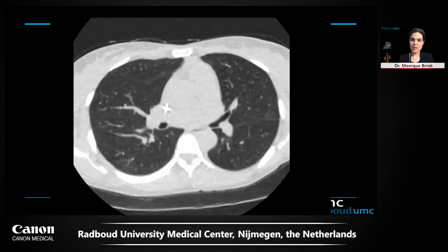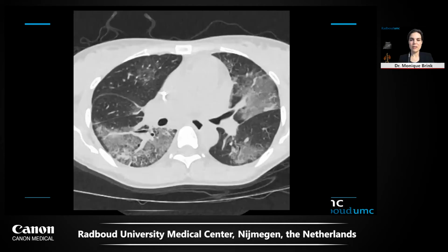Then we go to the next patient, and this patient has a hematological history, who was immunocompromised and presented to emergency ward with dyspnea and fever and cough for 2 days. And as you can see, this is a CO-RADS 1 CT scan. So a CT scan with normal pulmonary parenchyma. However, after a few days, the patient got worse, had a positive PCR for SARS-CoV-2, and finally developed typical CT abnormalities resembling COVID-19. And this is an example of a false negative CT scan.